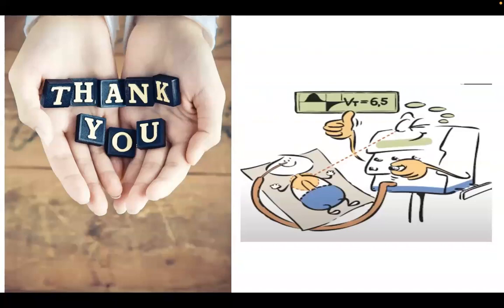Another important thing in the VN series type of ventilator is this. In volume guarantee ventilation in Babylog 8000 or other ventilators, suppose 6 ml of tidal volume is delivered and 2 ml has been lost during inspiration. That means 4 ml has gone to the alveoli. During expiration also some amount of volume will be lost, like 1 ml. That means what is actually measured is 3 ml. But in reality, it is not 3 ml that has been delivered to the alveoli. It was 4 ml, but because during the expiratory phase there was also a loss of 1 ml, the tidal volume measured at the proximal end is 3 ml. So that is not correct.